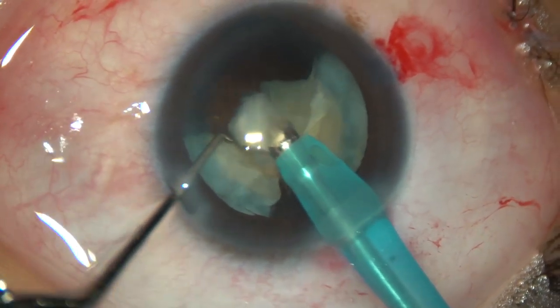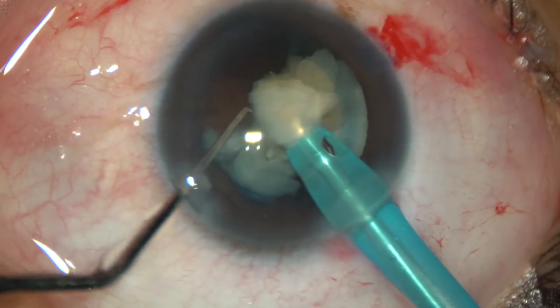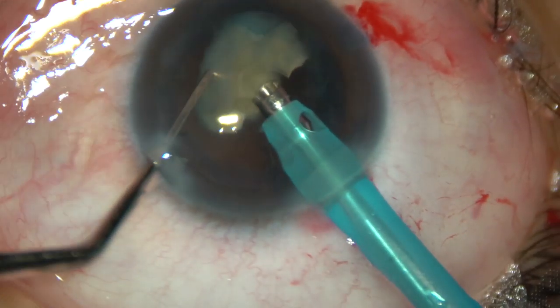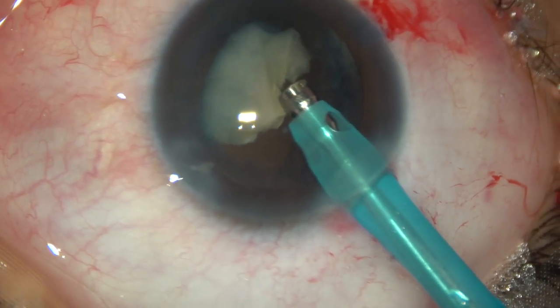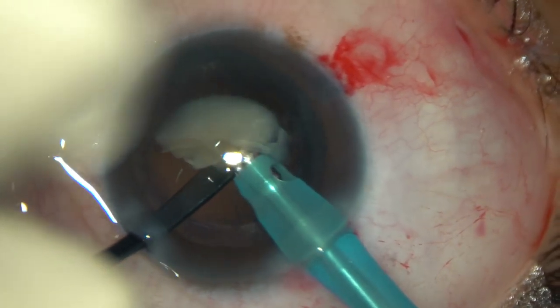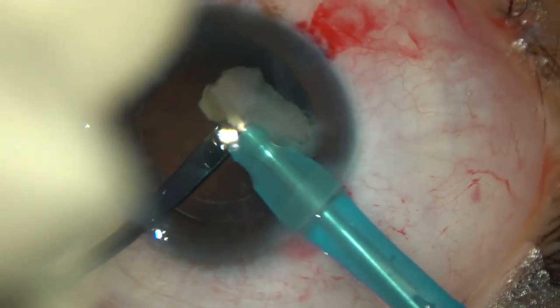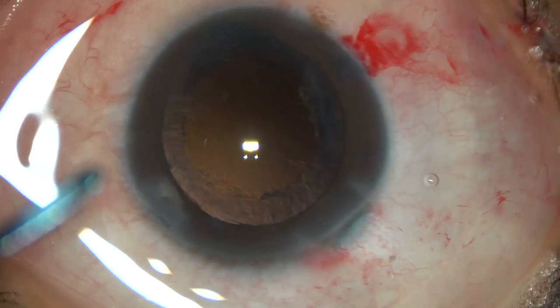In this case, there is no epinucleus covering the posterior capsule. Once we see this, we must be very careful while emulsifying the last piece, because since there is no epinucleus covering the posterior capsule, the risk of posterior capsule rupture is more in such cases. So I am using this posterior capsule protector — it is a thick instrument and we get a lot of space over it to emulsify the fragment. In no way does the posterior capsule come to the tip of the phaco needle.